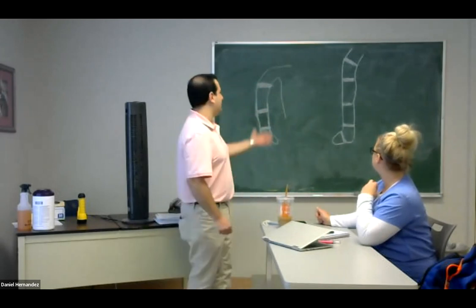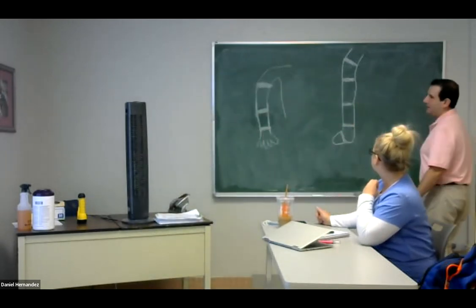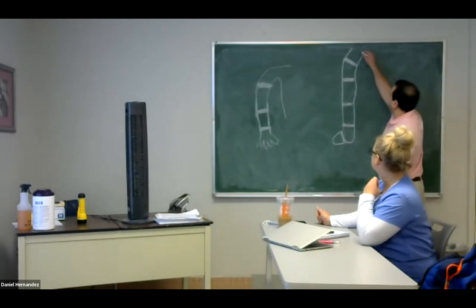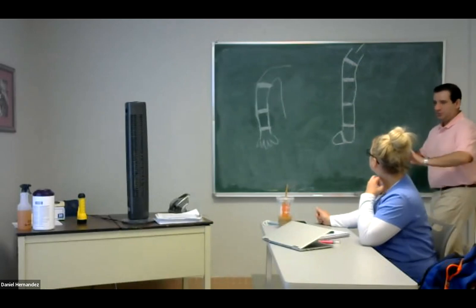Same thing for the legs now. You can do the same thing. If all of them were abnormal, then it would be your common femoral or your iliac. Even aorta, if it's both legs, it could potentially be aorta, because of the bifurcation. The boards love to trip you up.